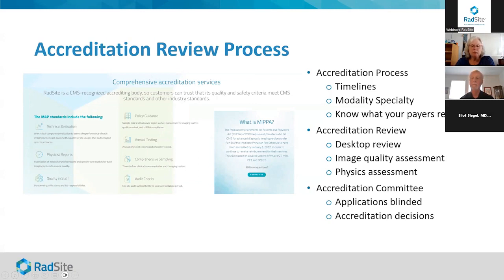The clinical images, this is all going to be dependent upon what specialties you have. If you're on the studies tab in the application, there is a link. It says view study submission requirement. If you click that link, it will open up and it will tell you exactly what studies, the number of studies and things like that that you have to submit.